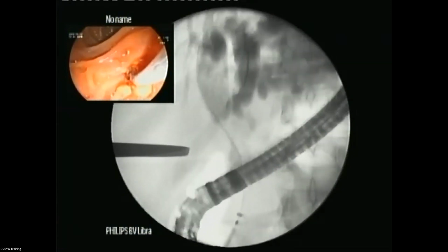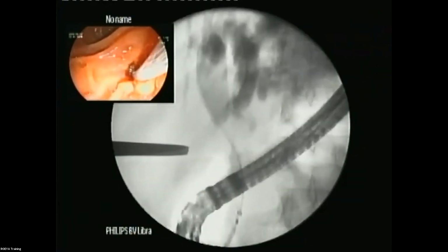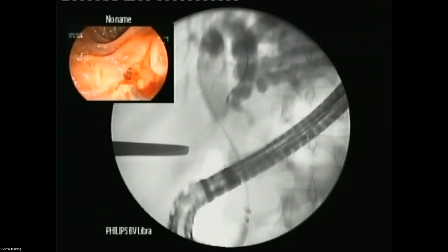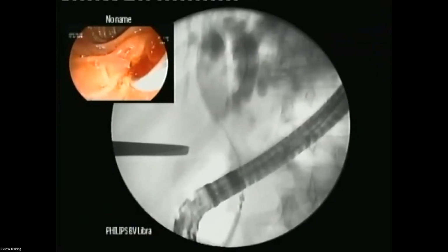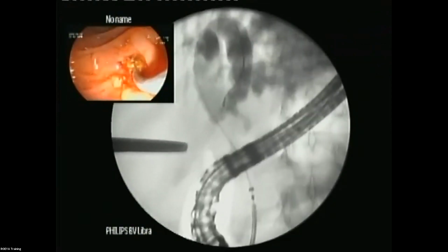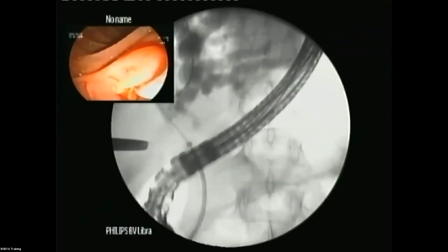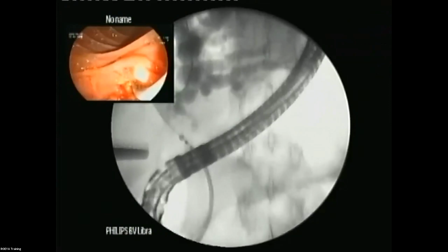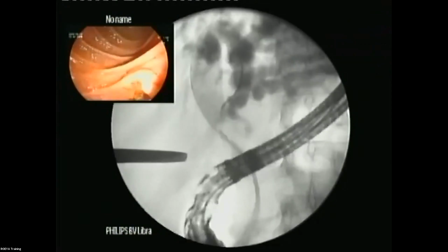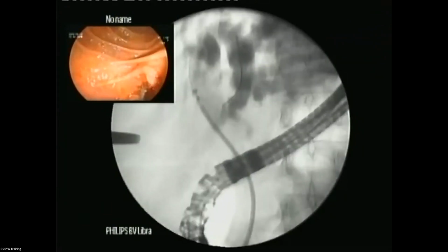Yeah, this is also, I will show it in my presentation, that till date with all the randomized studies, no one showed superior, whether it's bilateral stenting or unilateral stenting. There are some studies with unilateral, some other studies say bilateral. The only message which I have learned from last years, that whenever you put a contrast in a segment, you should drain. This is the message. So now we have put a contrast in the left system, so we will drain.